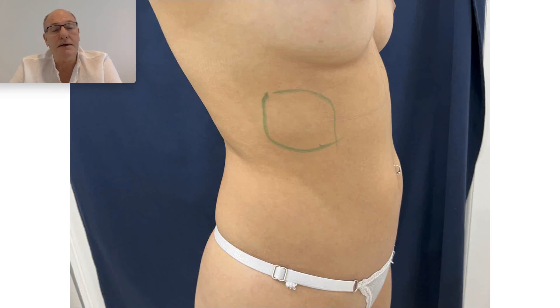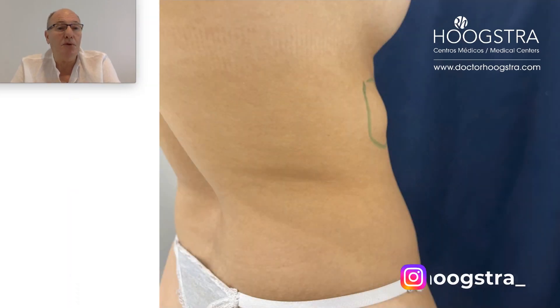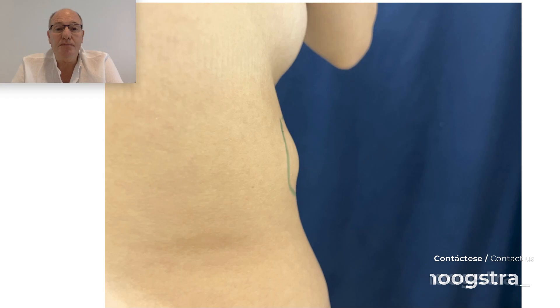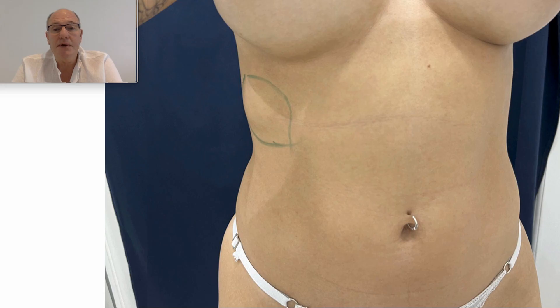For each of us, we don't like to have big scars. But some patients that work with their body — in this case, this is a model patient — come to my office looking for my technique of removing a big lipoma like this with a minimal scar. And we can see the big tumor.